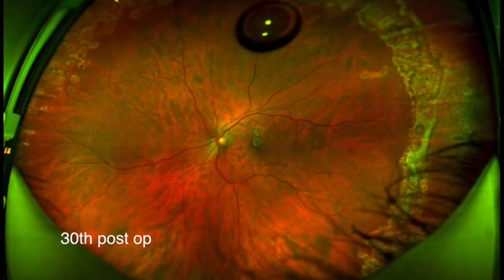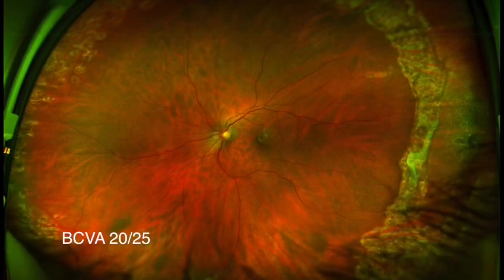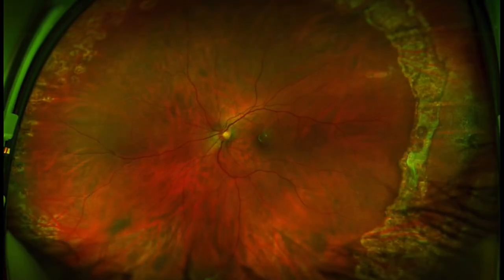We recommend placing a buckle if you aren't able to perform lens removal and IOL placement at the same time. Another situation where an encircling band may be necessary is in cases with PVR.